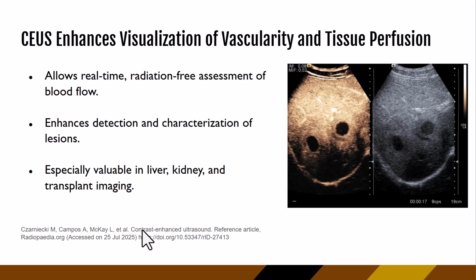Now, as sonographers, we are usually there to assist with the contrast-enhanced ultrasound at this point in time, needing a radiologist usually present to administer the contrast agent and to watch and read the screen as the contrast is utilized. But I wouldn't be surprised if it already is happening or is going to start happening more and more, that as radiologists become more comfortable with them, it really could be a solo exam like it is for our cardiac echosonographer counterparts.